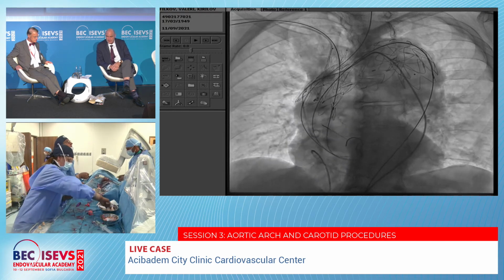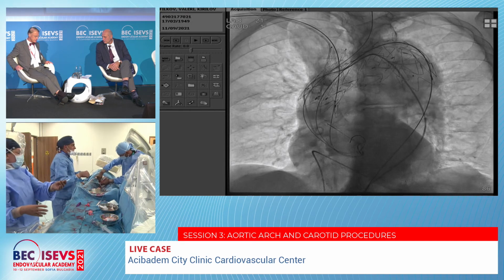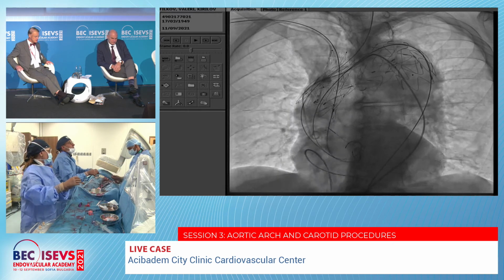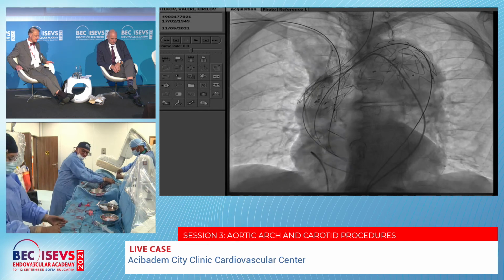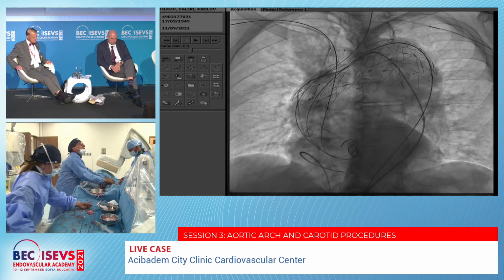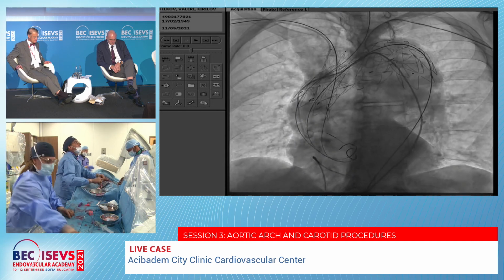What is the size of the catheter that you need to deliver the Amplatzer plug? Yes, because it's a larger Amplatzer plug, 6 or 8 French. 6 French will be enough? Yes. There are different plug sizes also, depends on that. It's also the question what is available in Bulgaria, yes. I have no idea.